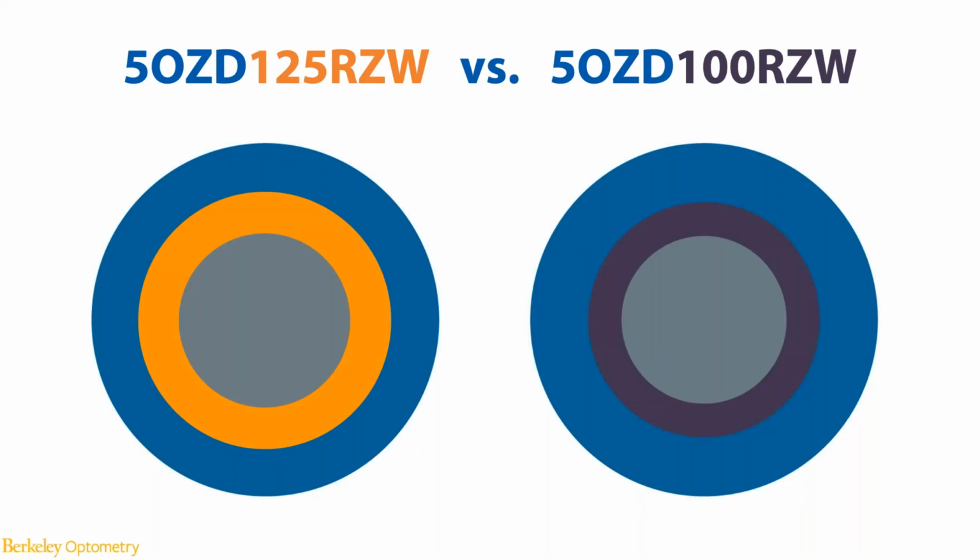Since Ortho-K has become one of the primary options, not only for myopia correction, but also for myopia control, how to design and fit lenses to achieve better efficacy in myopia control has been a very hot topic among researchers, clinicians, and the industry players. One of the most popular theories in the subject area is to design a lens with a smaller OZD based on evidence from several retrospective studies.